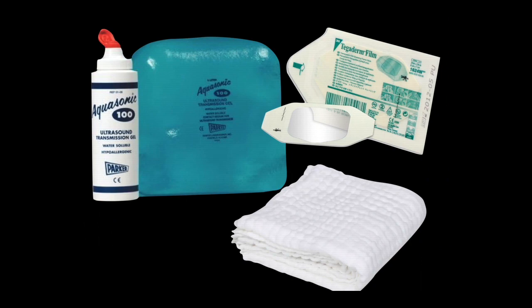So what you really need here are the objects you see. You need gel and lots of it. You need a towel to help clean the patient up when they're done. I tend to give them a little towel that I place in their hand so they can wipe gel away from their face as it drips down, and to let them wipe away the gel at the end of the exam, and plus or minus a Tegaderm.